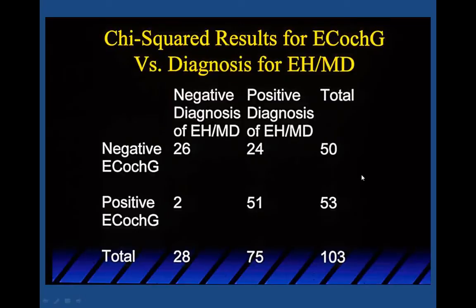One that we did several years ago took a look at the specificity and sensitivity of electrocochleography, the way we were doing it, using the SP-AP amplitude ratio.